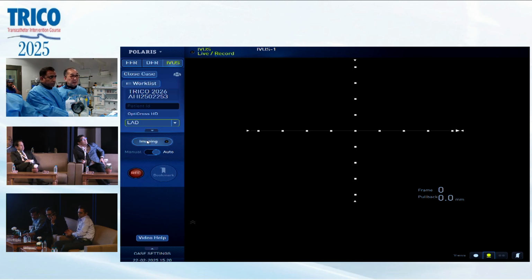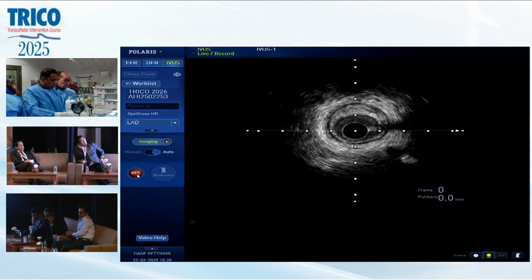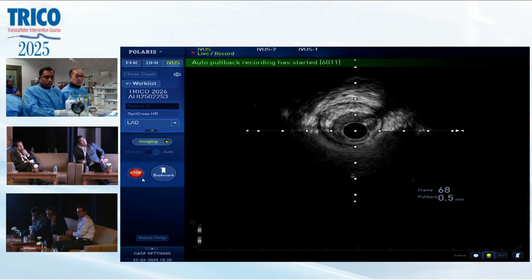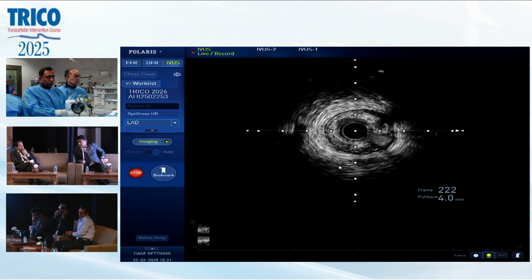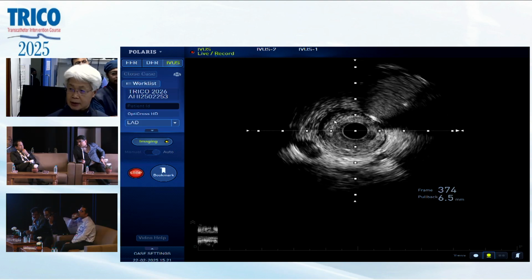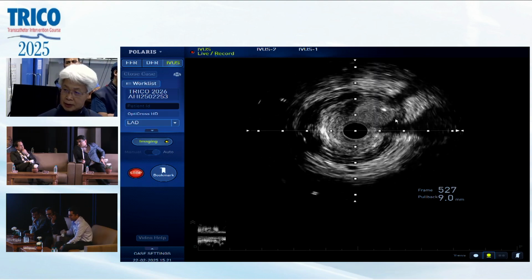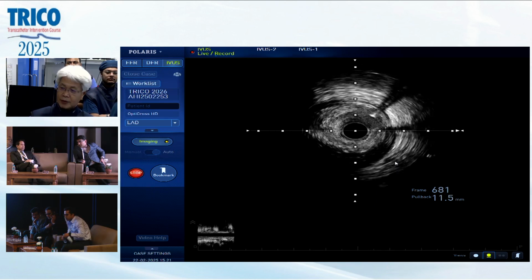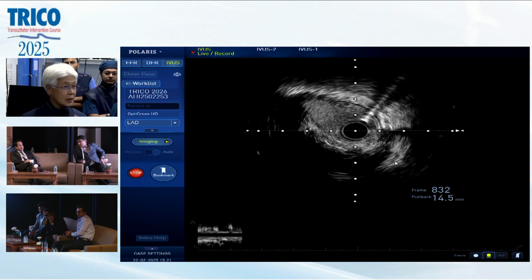Okay, let's IVUS here. Go. A little distal to the bifurcation, there is already some disease, but the plaque volume might be less than 50%, right? Coming is a perforator, and here already a lot of disease. And here is the bifurcation, the wire is coming here. And just proximal, the size is 4.5 but with huge disease, many disease. And this is another branch, right?